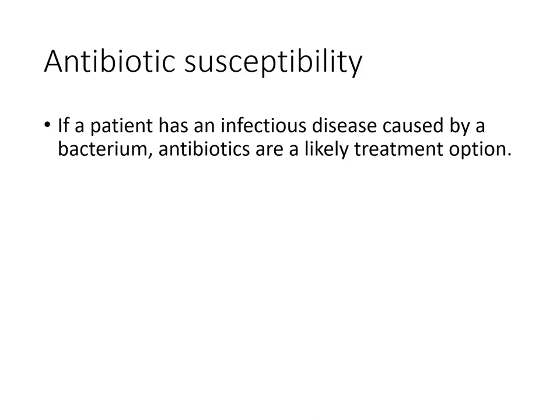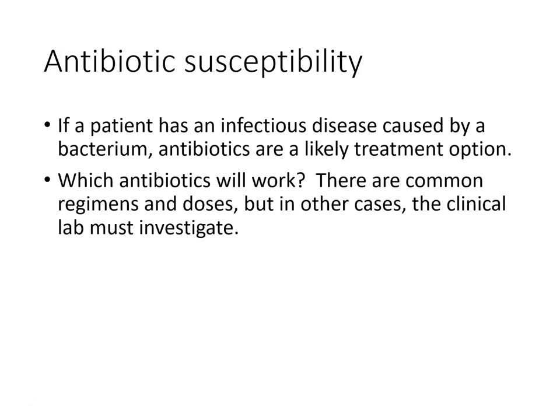We want to use antibiotics, but remember there are a lot of situations where bacteria are resistant to antibiotics. Maybe they have a plasmid that gives them an efflux pump that they use to push the antibiotics out of the cell. Maybe they have a beta-lactamase enzyme that works against the penicillins but not the cephalosporins. Maybe they have an extended spectrum beta-lactamase enzyme that inactivates all the beta-lactams. We don't know until we test it.